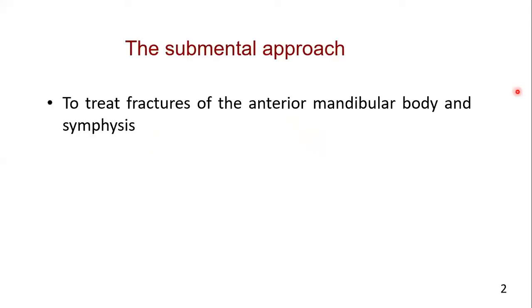In this video, we will explain the submental approach. The submental approach is used to treat the fractures of the anterior mandibular body and symphysis. Although these fractures are usually approached and treated intraorally, a submental approach may be indicated.